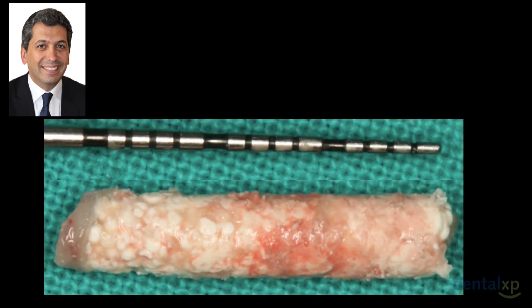But the only way to understand what happens inside every sinus we graft is to be able to retrieve a biopsy from each sinus. Because each sinus is unique and each patient is unique. A biomaterial that works fine in one sinus will not work the same in another sinus, because you should also know that there are some factors related to the patient, to the sinus structure, to sinus anatomy, to the way the surgery was performed, that will lead to lower or higher vital bone inside our graft.